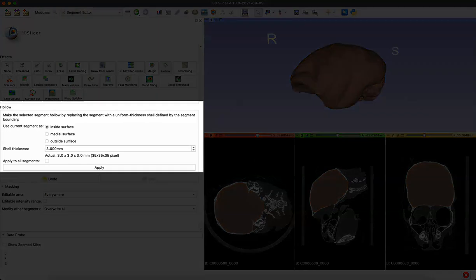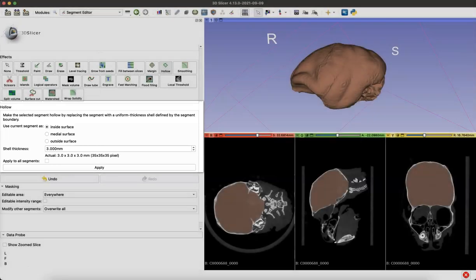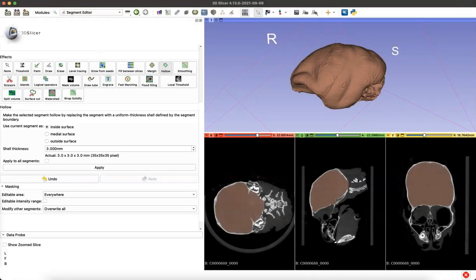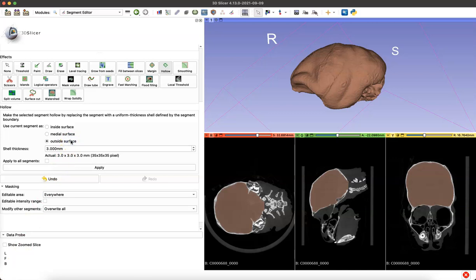We want to use the current segment of endocast as the outside surface of our model. I'm going to select outside surface and now that endocast that we created is going to become the outside shell of our hollowed out model.